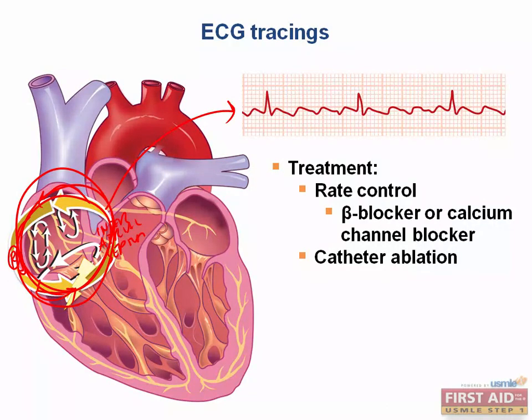This makes perfect sense when we look at our ECG. The tracing tells you what is going on. When you look at the ECG tracing, you see the repetitive sinusoidal sawtooth appearance of the flutter waves. That's because every time we get these sawtooth patterns, it's telling us that we're going through the same circuit over and over again. And that's why they all look rather similar.